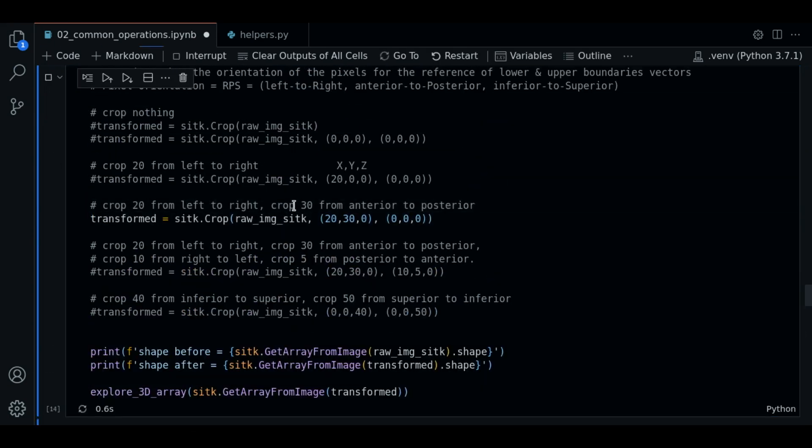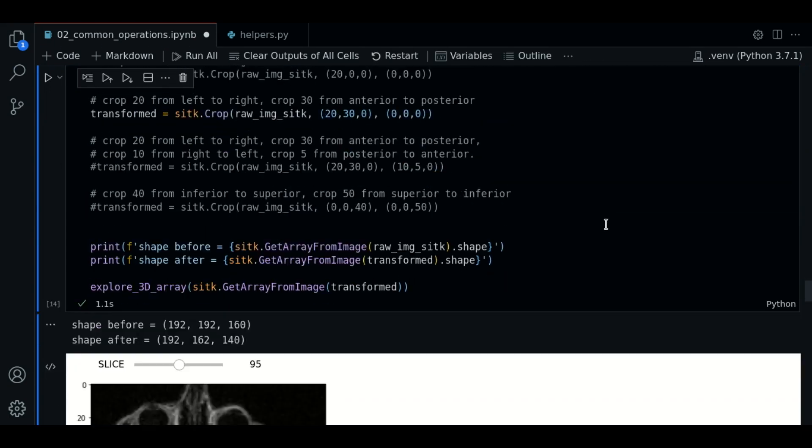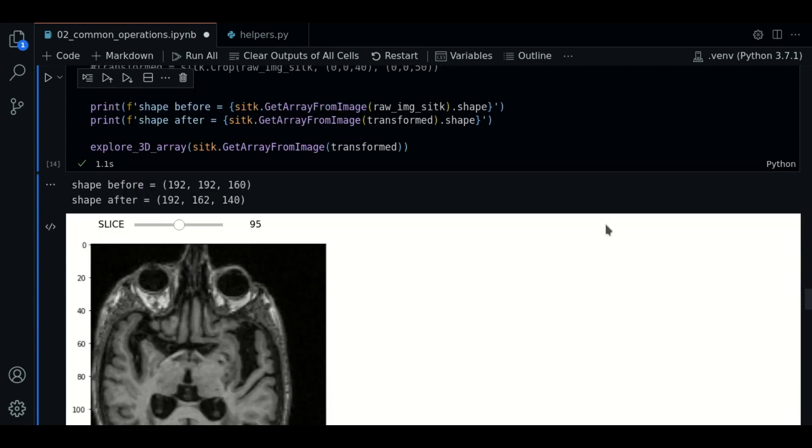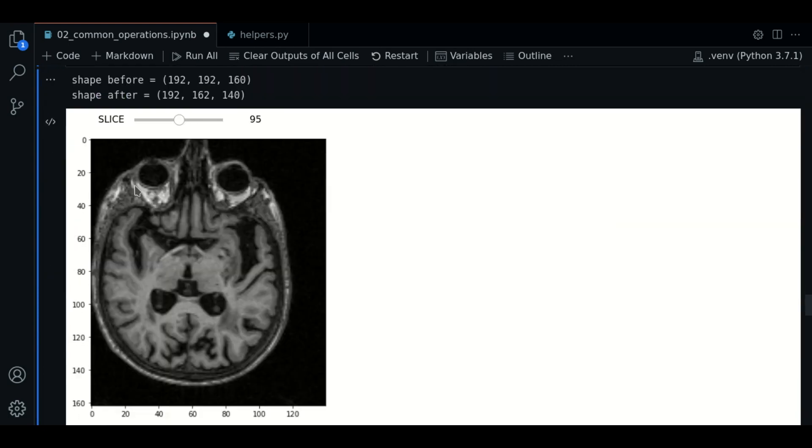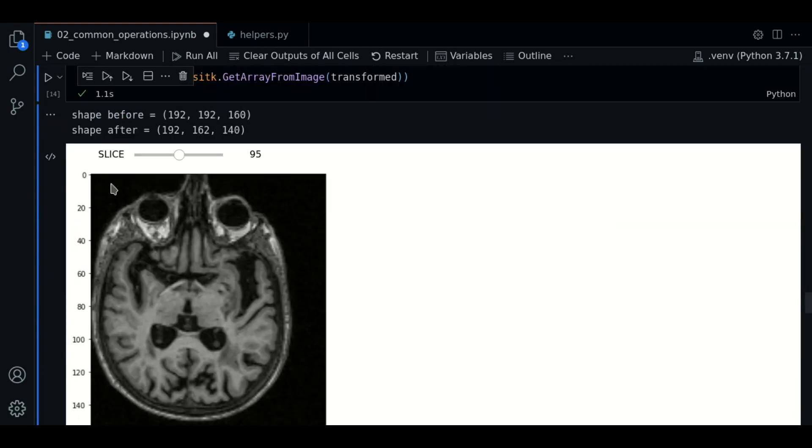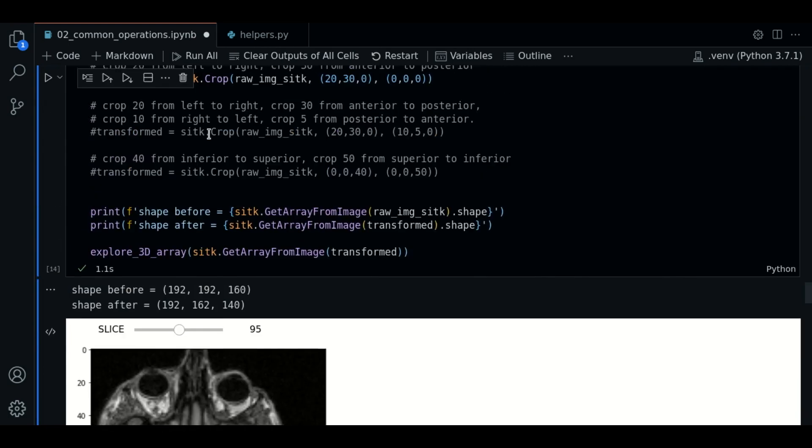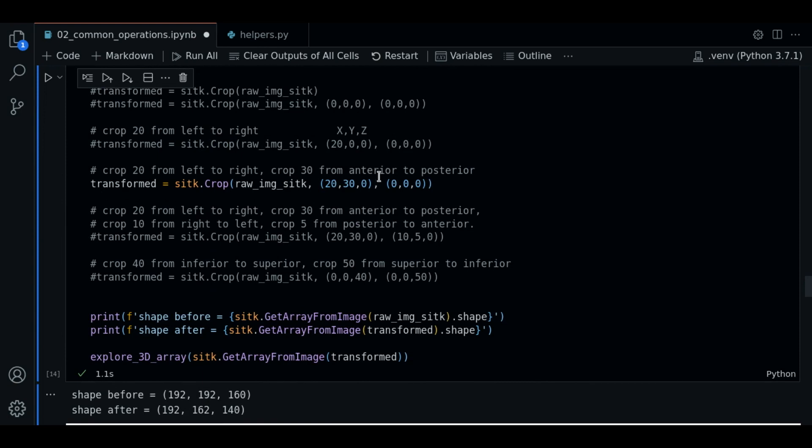We uncomment this and execute. And we'll see that the image is cropped in both sides. Cool.